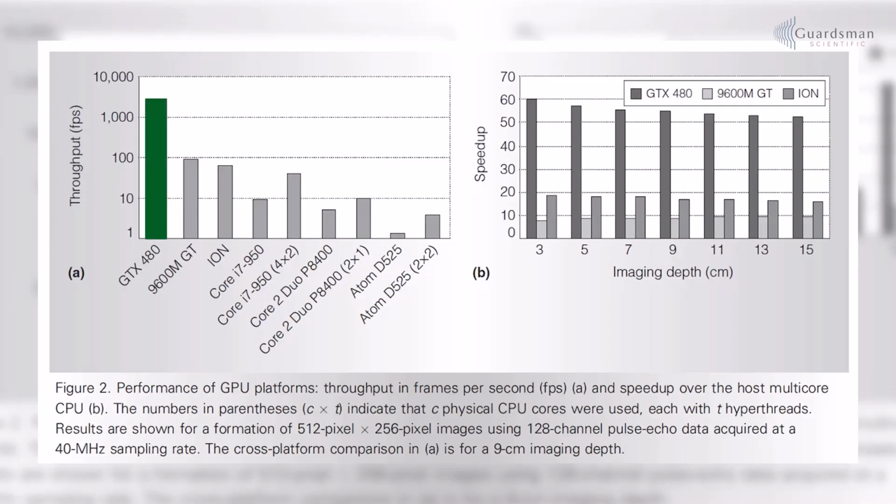And you can see that on the GPU side of things, the first graphic bar, you can process the information with about 1,000 times higher throughput. So logarithmically, several times higher processing power, and therefore you are able to get a lot more measurements with confidence.